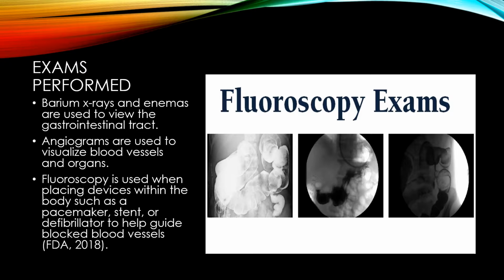During interventional radiology and cath lab procedures, on top of CAT scan, the patient may either have their skin numbed and medicated to calm the patient down, or the patient can request to be under anesthesia where the physician can either accept or reject this request. The radiologist handles the fluoroscope and CAT scan in interventional radiology, while the technologist is there to provide assistance. When it comes to the operating room, the radiologist does not need to be in there. Only the technologist is needed.